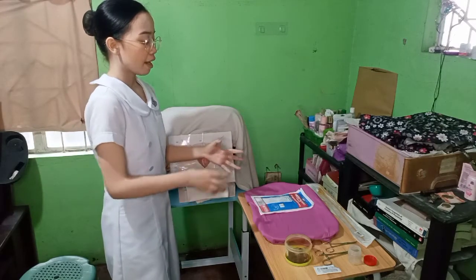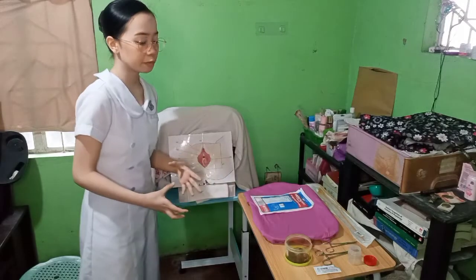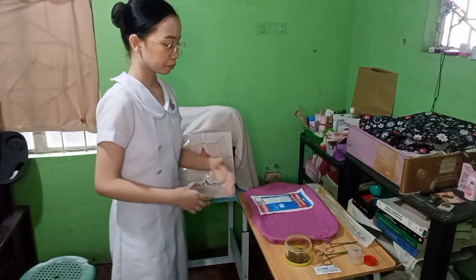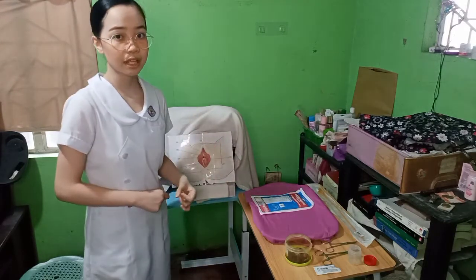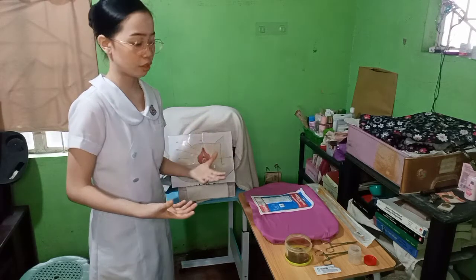And as we open the sterile gloves, we will make a sterile field out of it, in which we will be placing the 8 pieces of cotton balls with betadine solution, the water-soluble lubricant, and the catheter. The preparation of materials is necessary to save time and effort, and also to minimize the chances of us needing extra help while performing the procedure.